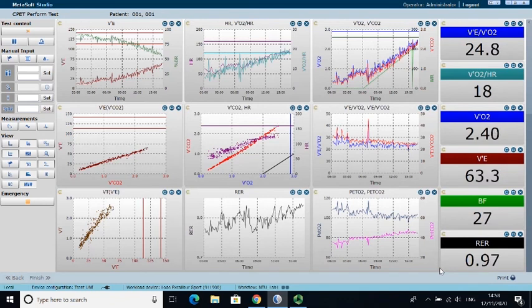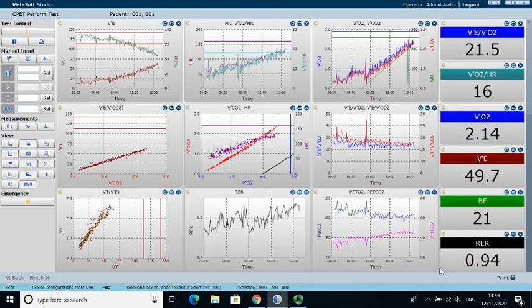And we can see now that Matt, when he's doing this test, is starting to get there a little bit now. He'll start to feel it, you know, he's at sort of 200, 230 watts. We can see his ventilation's now up in its 50s, so hopefully you're thinking to yourself, what would I expect somebody to get in an exercise test, and I give you that ballpark figure of 100, so we'll see what Matt gets to here.